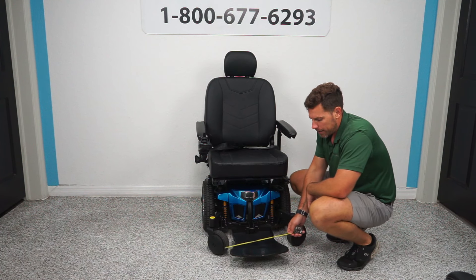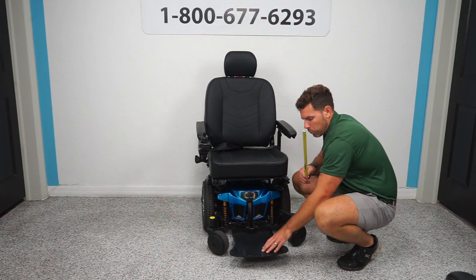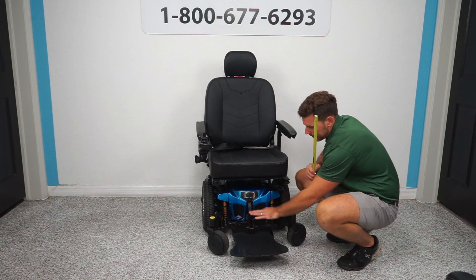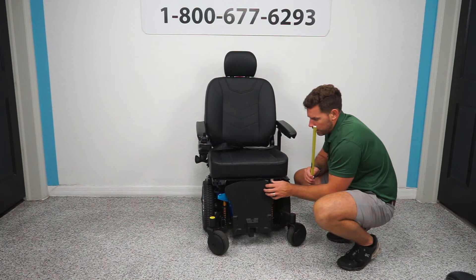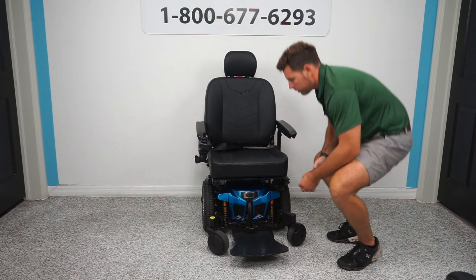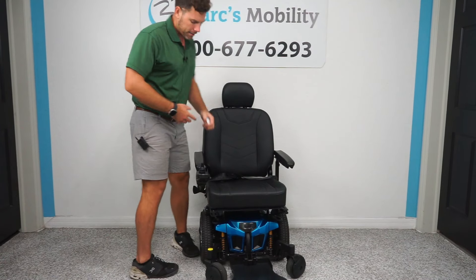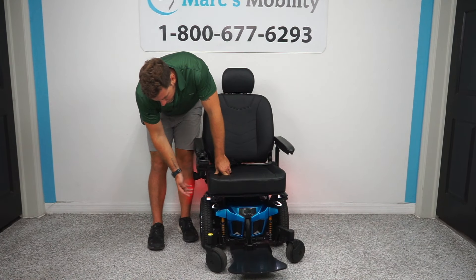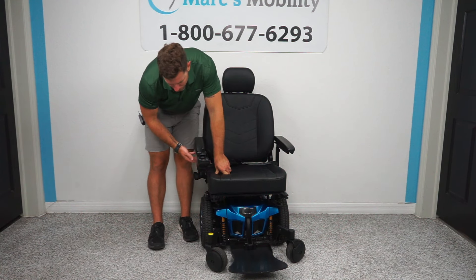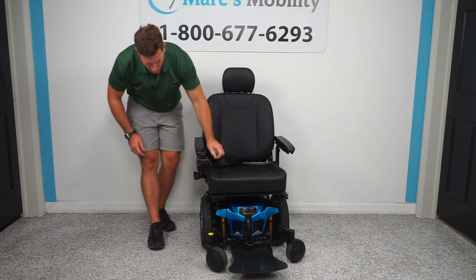Typically you can put your feet all the way out here and still have support, or if you tuck your heels back in here you don't have to worry about hitting a wall and getting your toes pinched. The footplate is height-adjustable and depth-adjustable and does flip up for easy access. This unit also comes with lights — there's a switch on the side that you can touch to activate lights in the front and tail lights in the back. This switch can be put anywhere, but on this one it's mounted on the side of the arm.